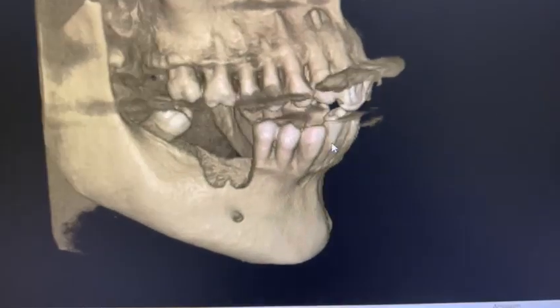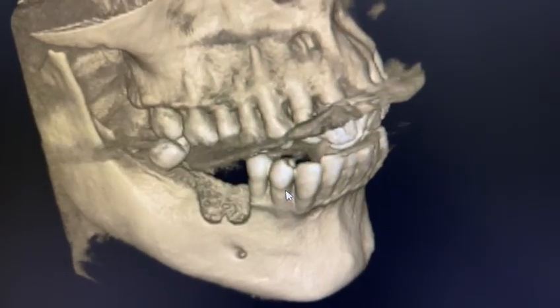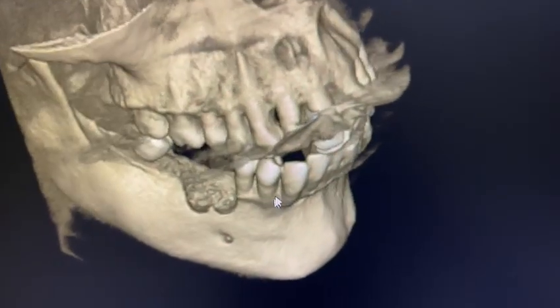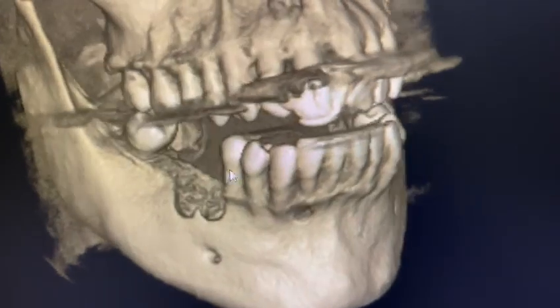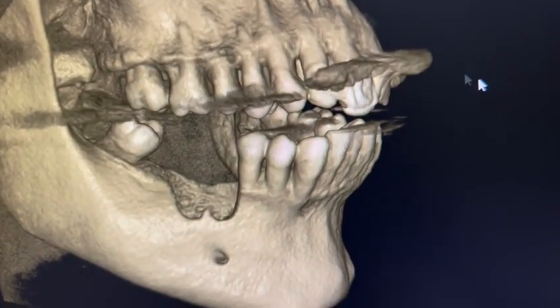This patient, we are planning for replacement of molars. The patient lost the molars. They automatically fell down after becoming mobile. There is severe buccal bone defect. So immediate implant and immediate loading we are planning for this.